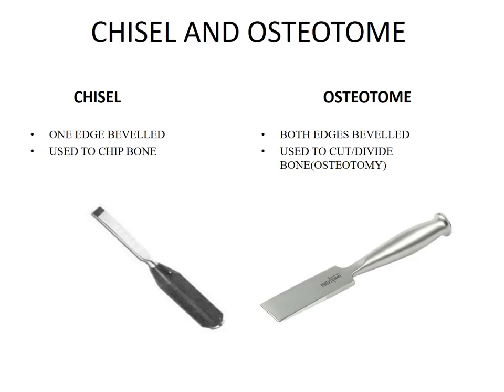Then, to freshen the bone margins or to raise osteoperiosteal flaps, you have an instrument called a chisel and an osteotome. In a chisel, only the one edge is beveled, means it is sharp only from one side. So that's how I used to remember C. Chisel C, so one cutting edge. Whereas in osteotome, both the edges are beveled. So C, other side also C makes an O. So it has got both the edges sharp or beveled.